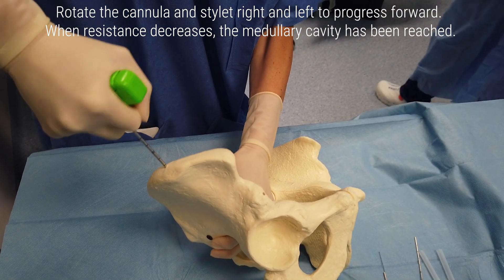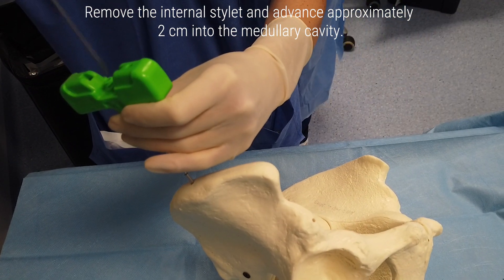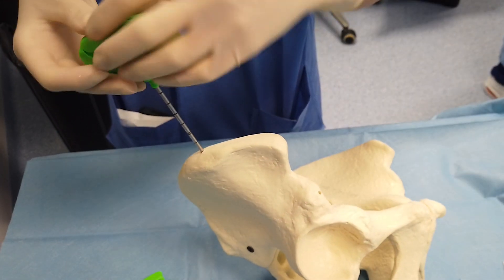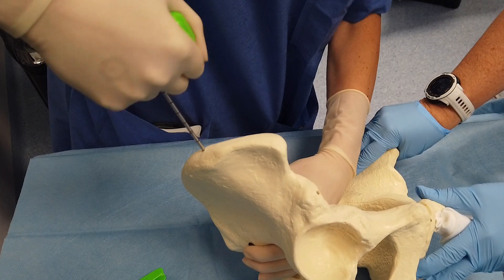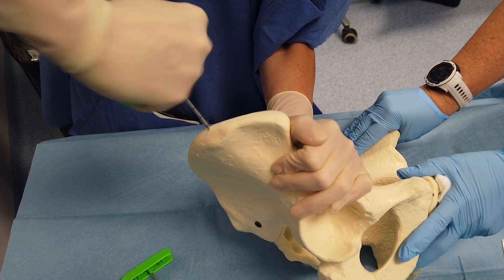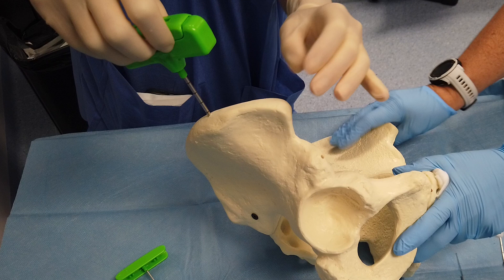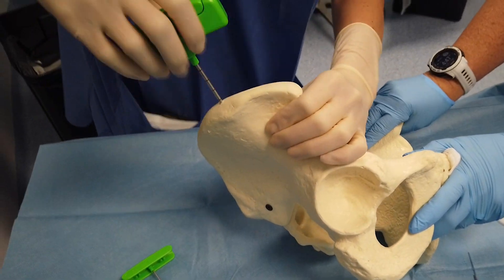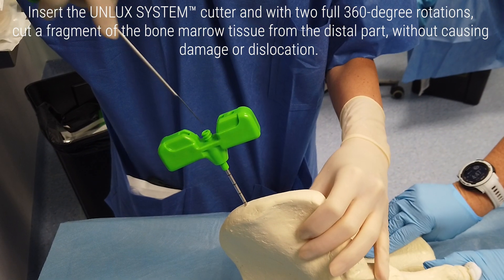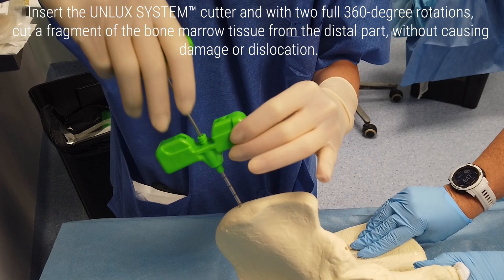When resistance decreases, the medullary cavity has been reached. Remove the internal stylet and advance approximately 2 cm into the medullary cavity. Then insert the UNLUX SYSTEM cutter and, with two full 360-degree rotations, cut a fragment of the bone marrow tissue from the distal part.